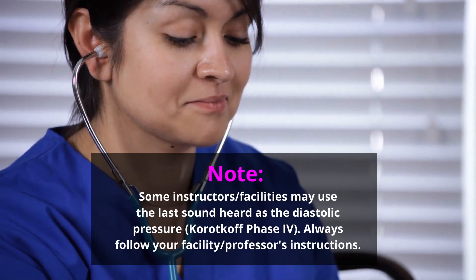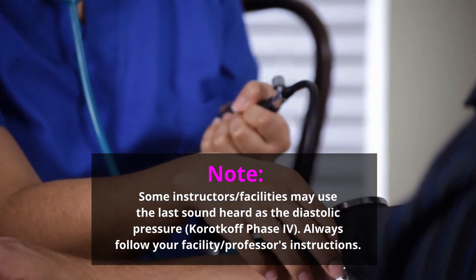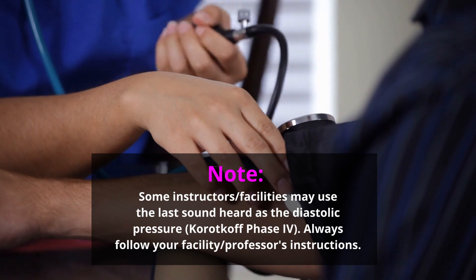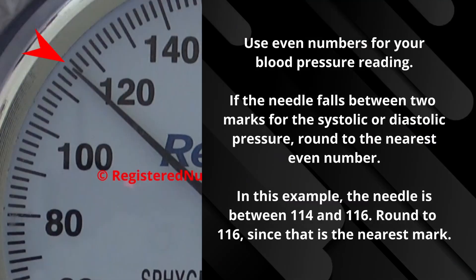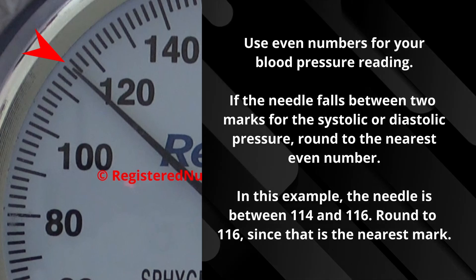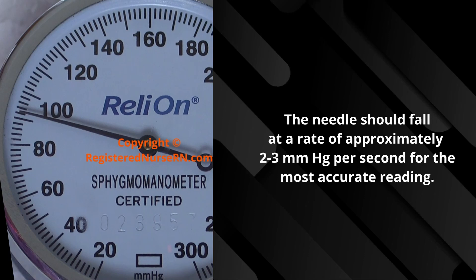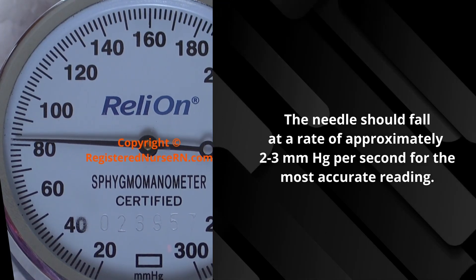It's important to note that some clinical instructors may use the last sound heard as the diastolic pressure, so follow whatever your instructor tells you. In a manual blood pressure reading, you generally want to state an even number for each reading — if that needle falls in between two numbers, just round to the nearest one. Also, you want to try to keep that needle falling at a rate of two to three millimeters of mercury per second.